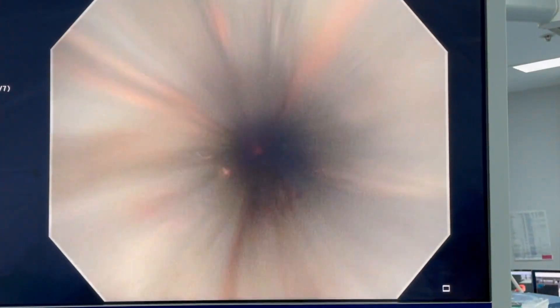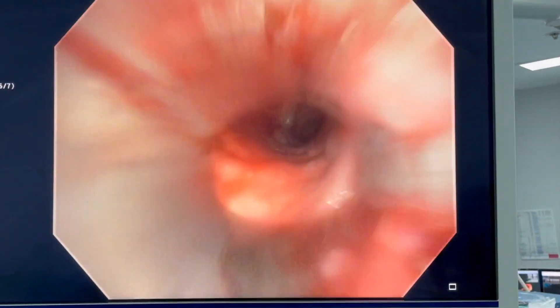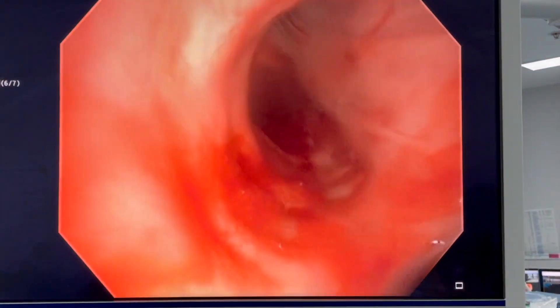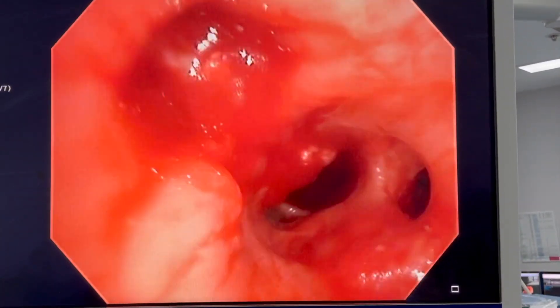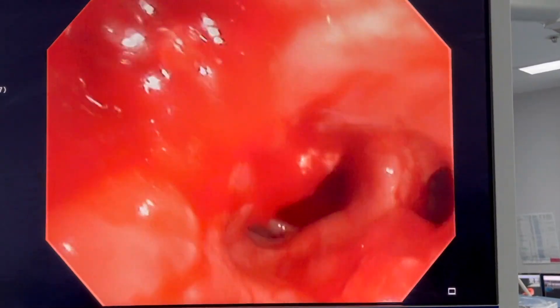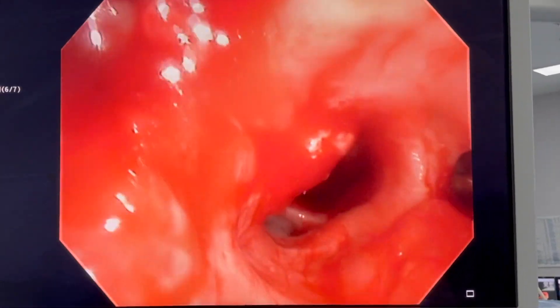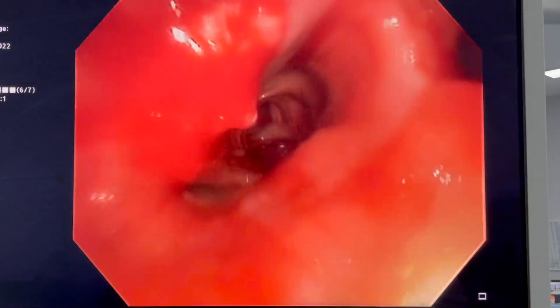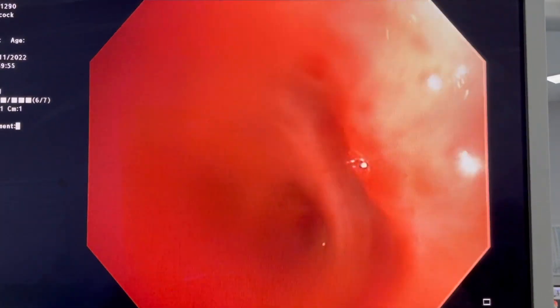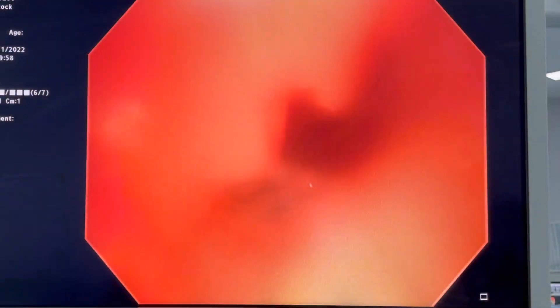This technique is called cryodebulking. Once I've done that a few times I can remove a large amount of that tumour to restore patency of the right lower lobe, which you can see there, and the right middle lobe still has some tumour so we can take more of that out. You can see now that we can get into the right lower lobe — that will certainly allow aeration down there, help open it up, and reduce infection. You can see some thick mucus down there consistent with infection, which is similar to what we saw on the CT scan.